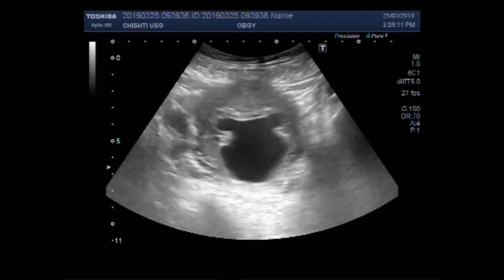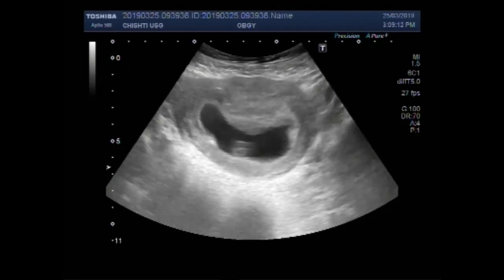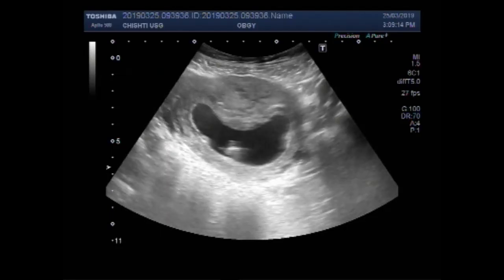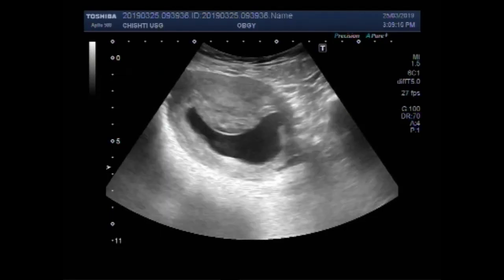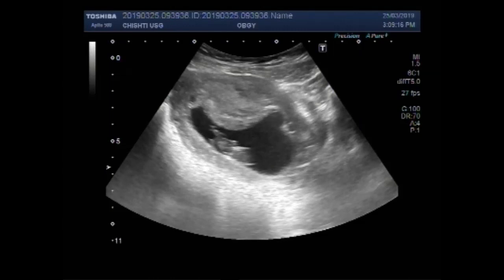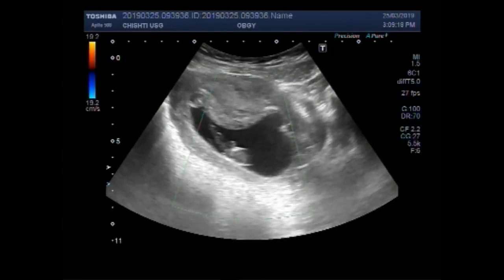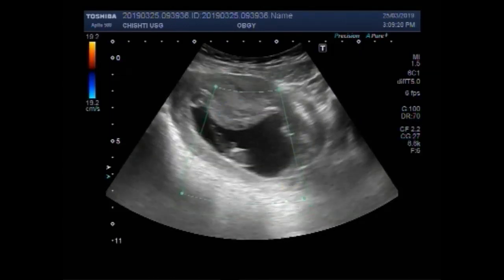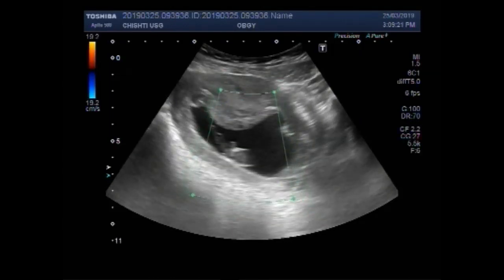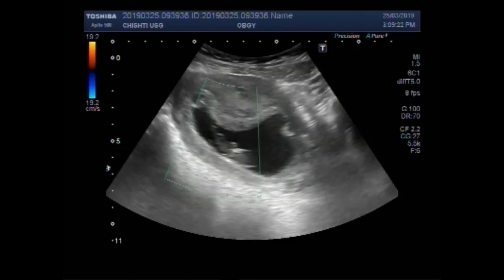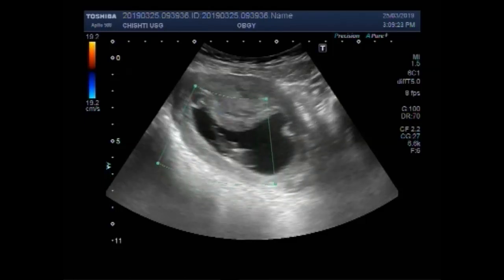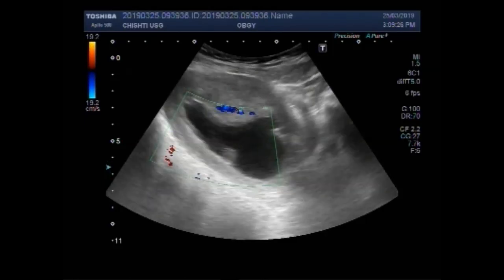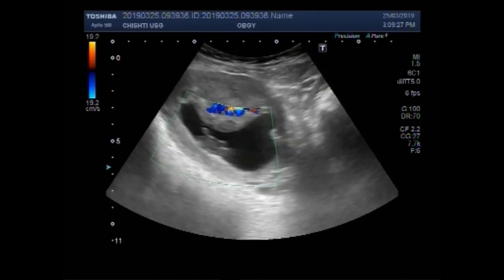The pregnancy measures about 10 weeks. Blood flow is not seen, not visible inside the fetus.